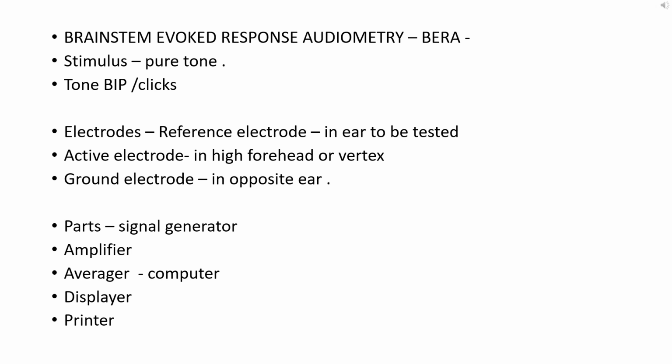So what is BERA? BERA is basically brainstem evoked response audiometry. There are other synonyms also, such as ABR, that is auditory brainstem response, and there are a few other synonyms, but I will not go into much more details. Let's understand the basic concept.